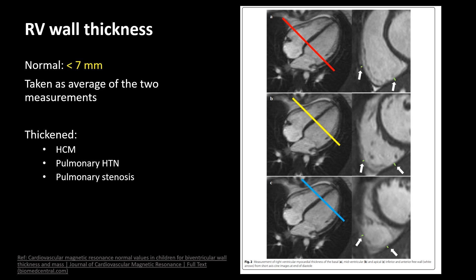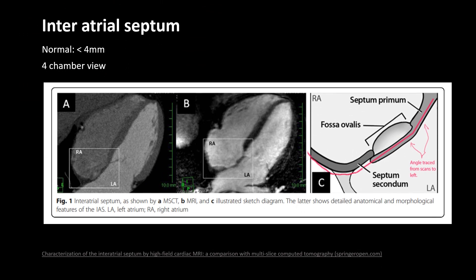For the right ventricle, normal RV wall thickness should be up to 7 mm, and this can be thickened in HCM, pulmonary hypertension, or pulmonary stenosis. The interatrial septum can be measured in the 4-chamber view and should be up to 4 mm normally. Here is a detailed anatomy of the septum.